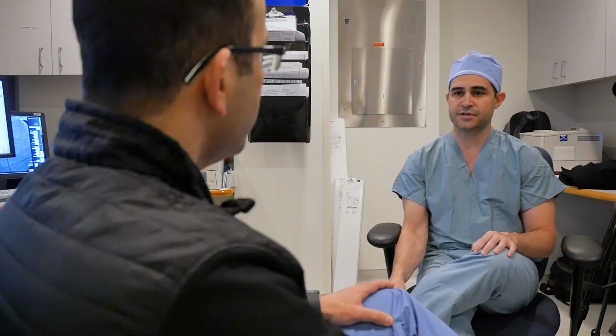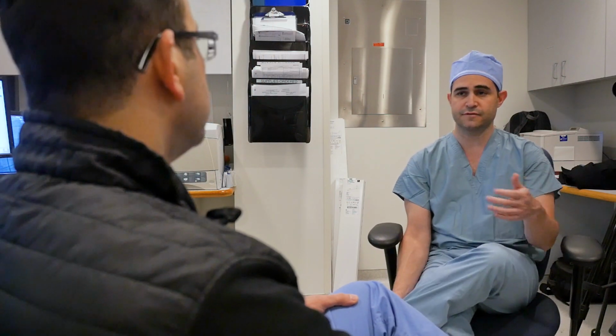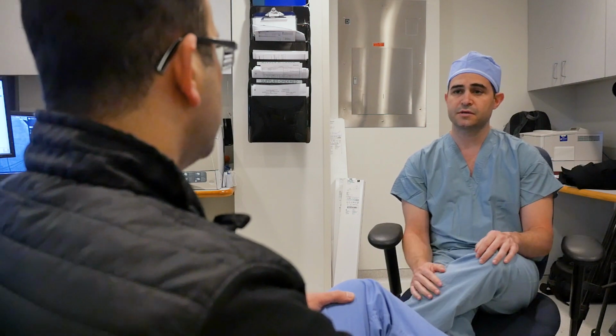We do these procedures on general anesthesia. Yeah. Do you think that affects this as well? Because I would expect somewhat that you would have to give higher dosages of isoproterenol and other things. Yeah, I think for triggers of AF, I don't know, because we haven't had the luxury of comparing patients awake versus patients on general anesthesia. We are now in the mode that we just do all patients under general anesthesia.